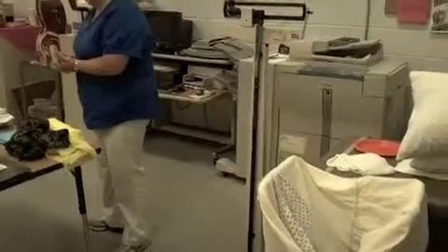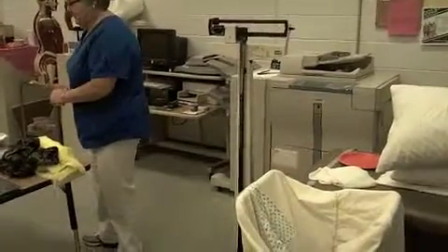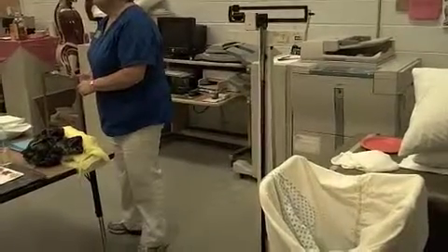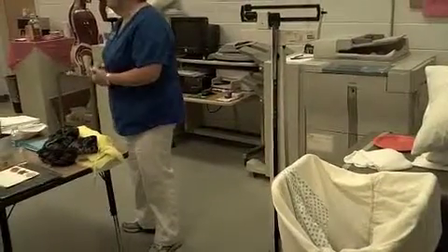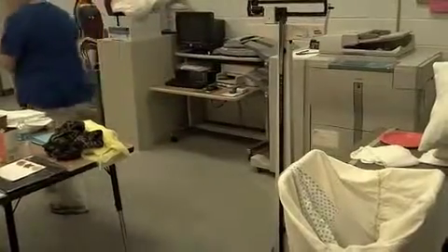What's skill number 3? Zero the scale. Okay, what's skill number 4? Stand next to him and help him. Assist them. Assist client if needed. How do we determine if it's needed?